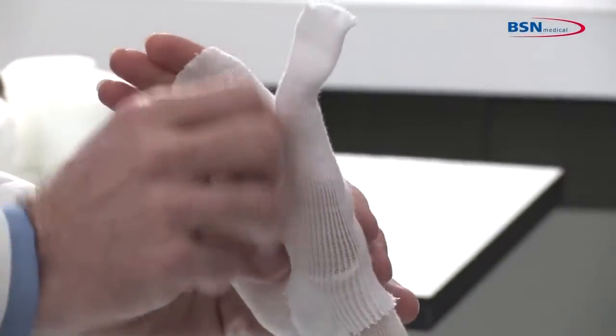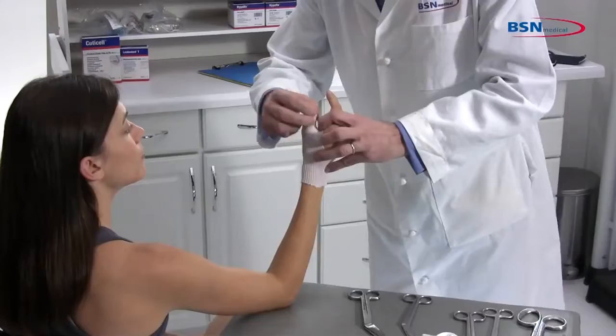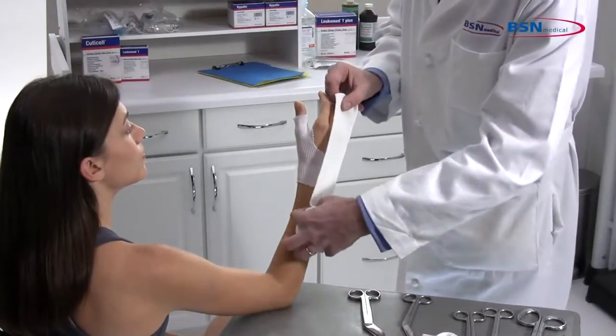Another option is to measure the length and make a cut to slide over the thumb. Select a stockinette that will not be restrictive at the widest part of the limb.